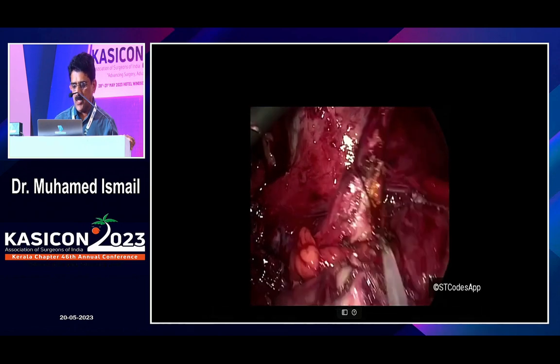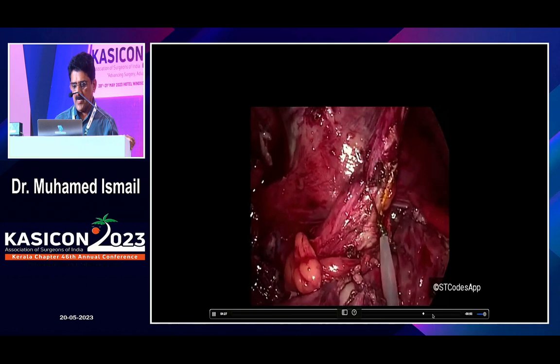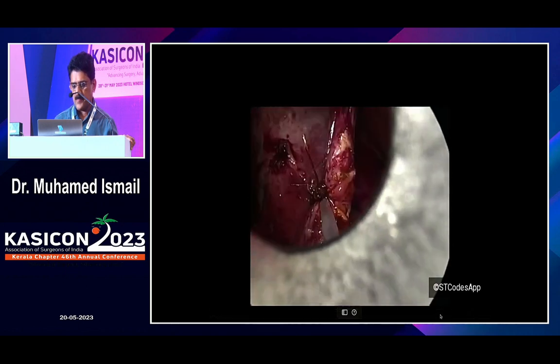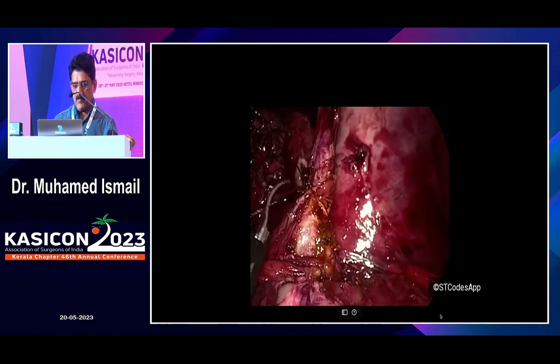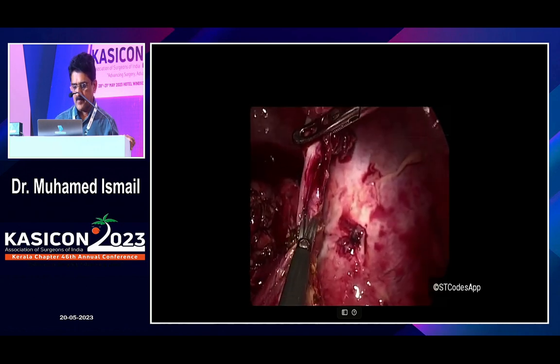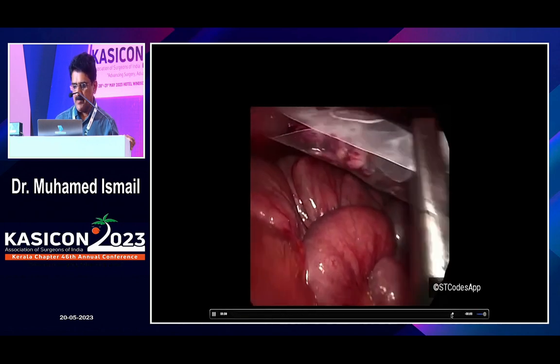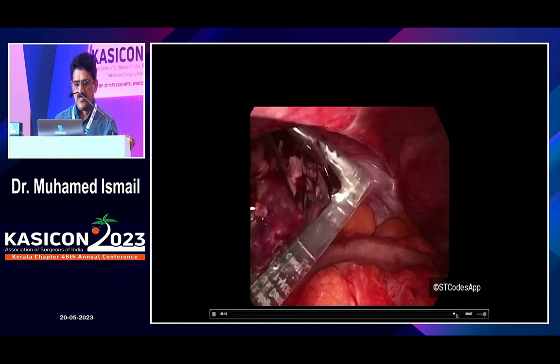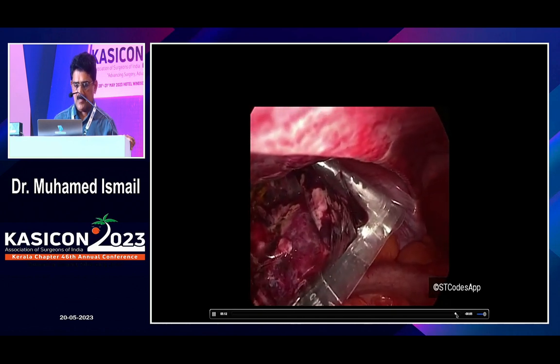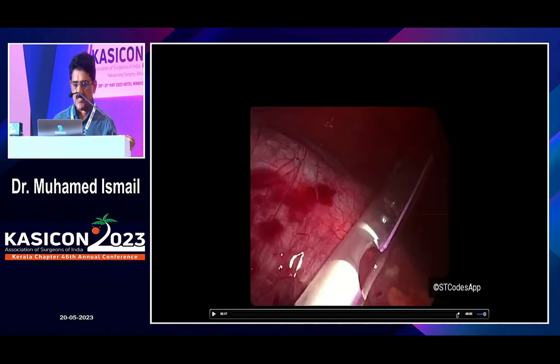Now we put the loop. We performed a thorough peritoneal toilet and the specimen was removed in a bag with a drain. This patient was kept nil per oral for 24 hours, then we slowly started oral fluids, and the patient was discharged on the third day.